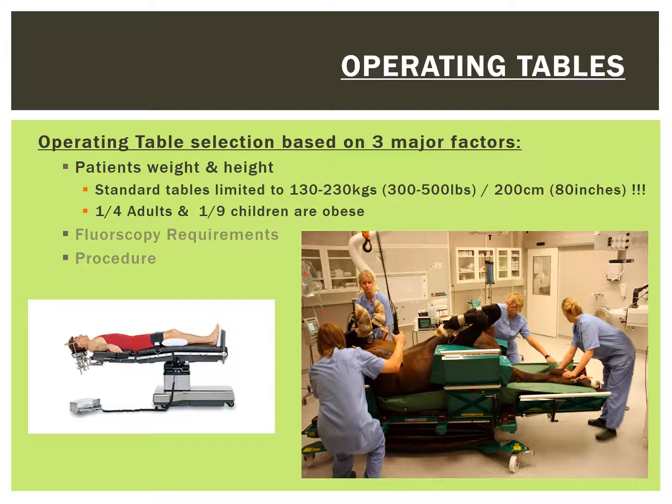Alternatively, there are tables that can carry up to 1,200 pounds or 500 kilos, but thereafter, veterinary tables may be required, or you can also strap 2 beds together to accommodate the patient.